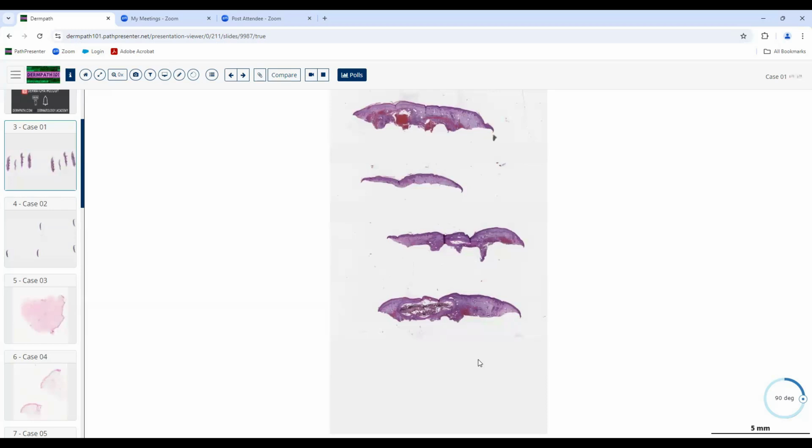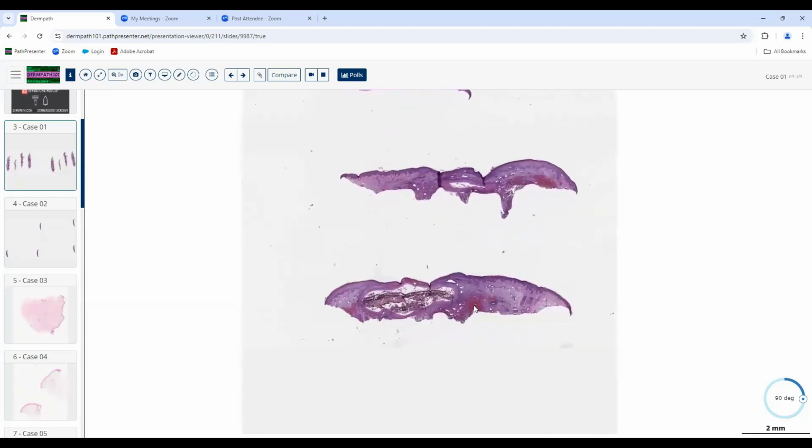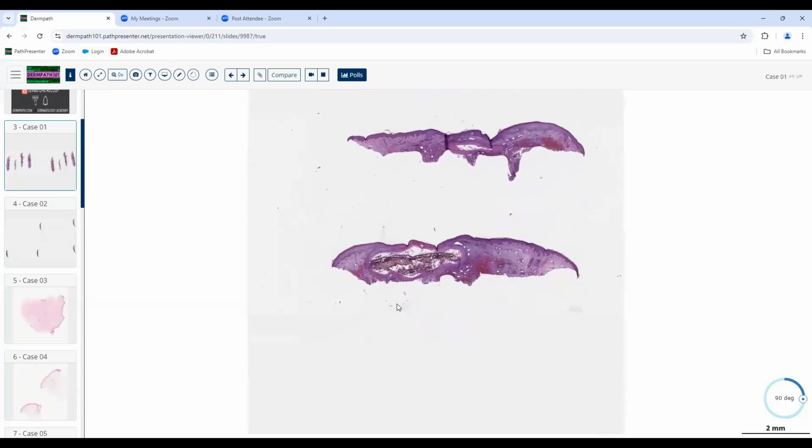But anyway, first we have the shave biopsy. And you all know we always start off and ask what kind of biopsy we're taking. It's interesting because this is an inflammatory process, but they probably thought it was a neoplasm. And we see this actually fairly common. Somebody will have a little papule there, and maybe it's due to inflammation. That's not something you're taught in residency very frequently.